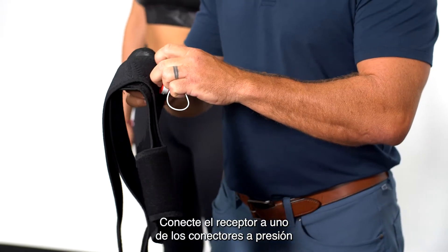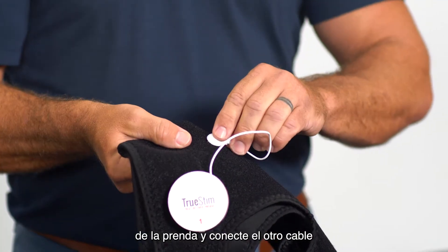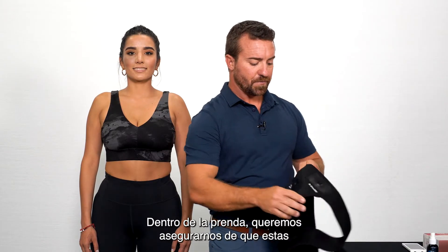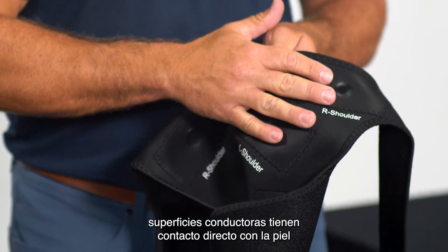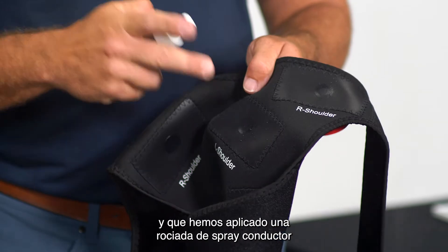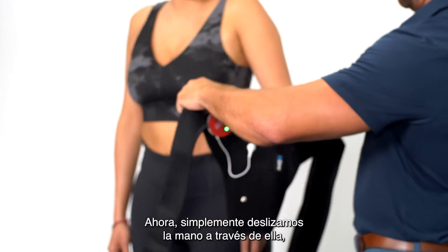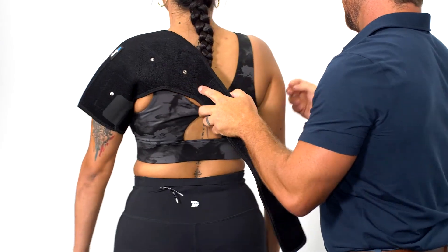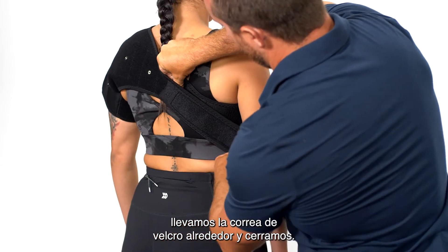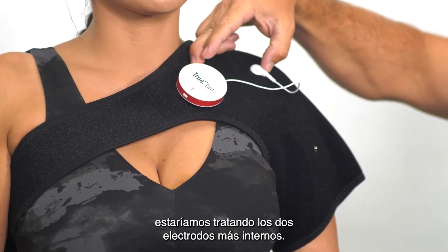Connect the receiver to one of the snap connectors on the garment and connect the other wire to the other snap connector. Inside the garment, we want to be sure that these conductive surfaces have direct skin contact and that we have applied one pump of conductive spray to each conductive surface. Now we simply slide the hand right through, bring the Velcro strap around, and close. With this arrangement, we would be treating the two innermost electrodes.